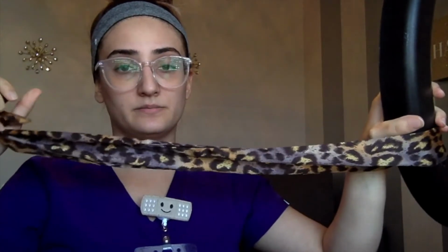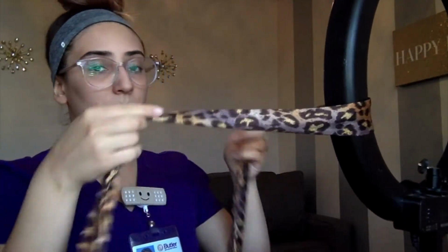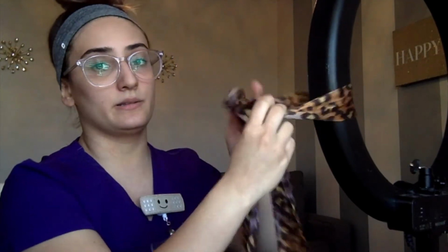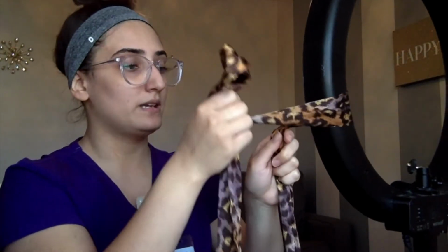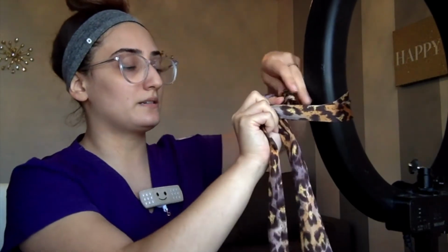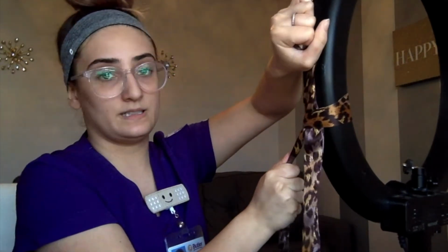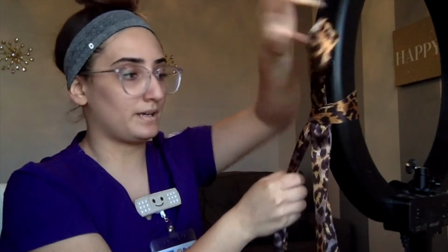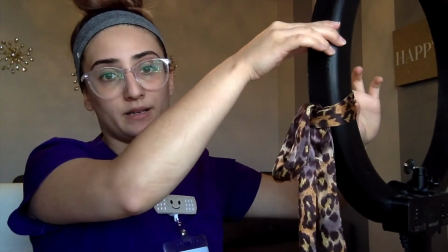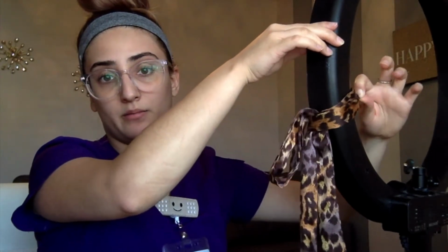I'm going to go ahead and make sure that the edges are even. Okay, so first I'm going to grab the end towards me, and then the end towards the outside, I'm going to make a loop like this. Okay, now I'm going to go over and under, and then I'm going to tighten. Okay, so if I pull, as if the patient's pulling on the restraint, there's not much to pull.